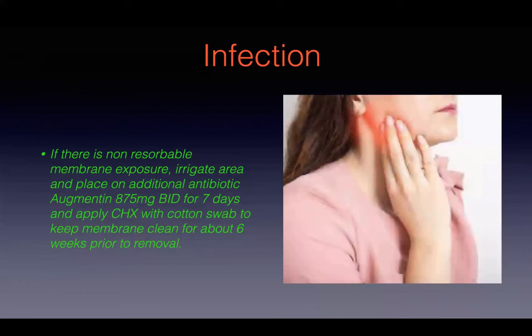I sometimes tack the resorbable membranes. For me, my rule of thumb is if I'm having to put a large membrane over more than one site, I tend to tack. If I'm just doing one site, I just kind of slip that membrane in there. And if I feel comfortable that it's secured in there just between the periosteum and the bone, I leave it. So no, I don't tack in every situation.